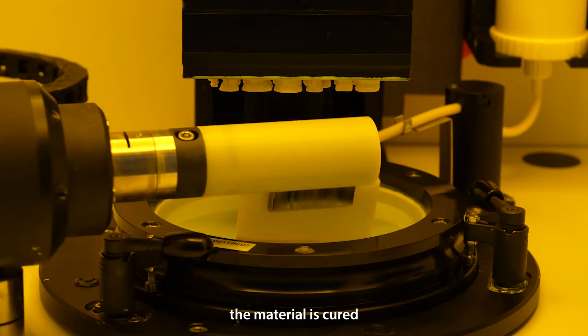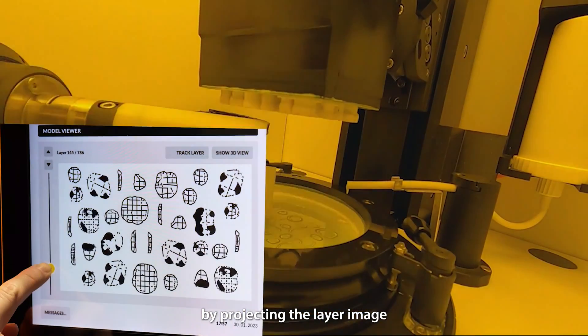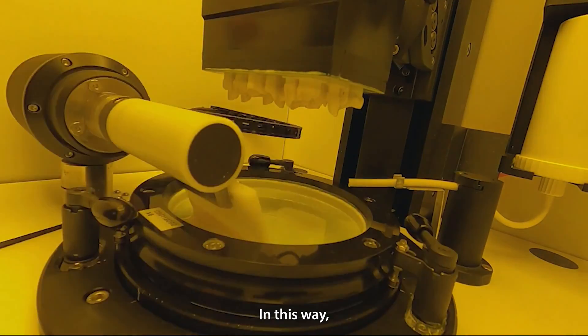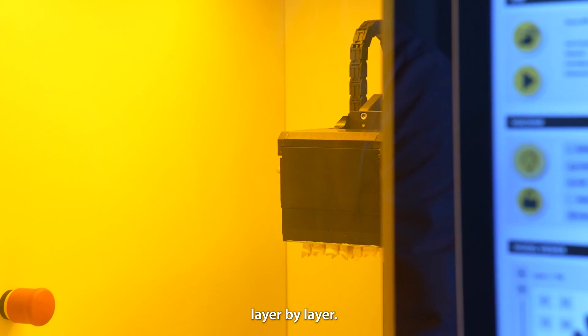To print, the material is cured by projecting the layer image through the transparent vat and onto the layer of slurry. In this way the green body is built up layer by layer.